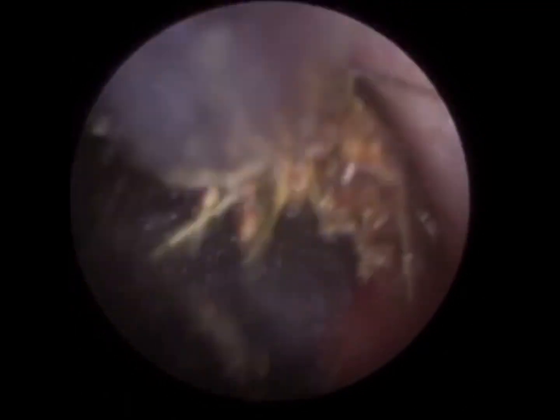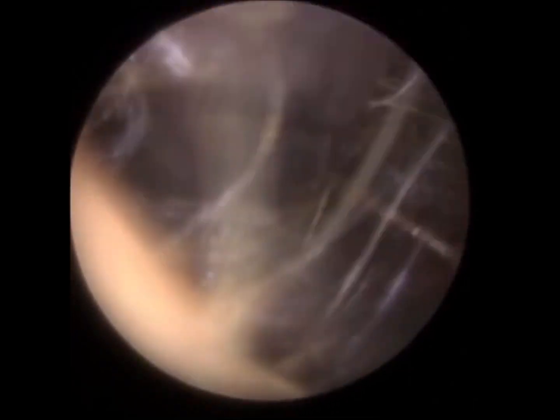When the ear is so blocked and you go in with an instrument, you don't know how deep you can go safely because you can't see the ear canal, it's completely blocked. So it could have been that, or I've got a feeling it's more to do with, as you saw earlier when I was elevating and lifting the plug of wax, there was a bit of keratin at the base of the ear canal, a lighter brown colour, that was coating the wax. As we lifted that, it just caused a bit of blistering. So this piece of wax is a bit firmer, almost like a crust on the outside, and in the middle it was a core, hence why I made reference to chocolate fondant cake.